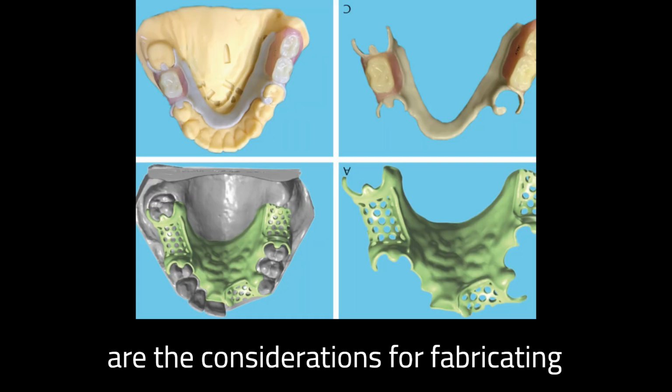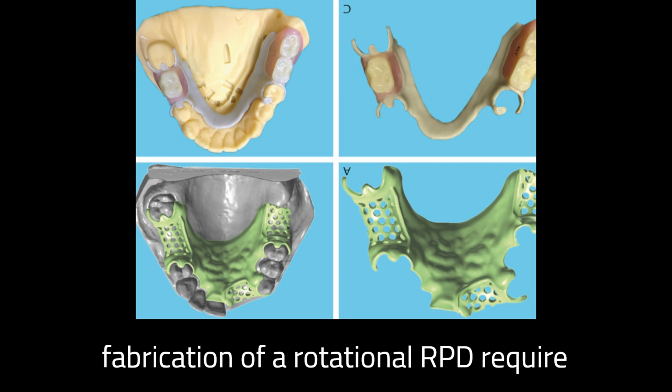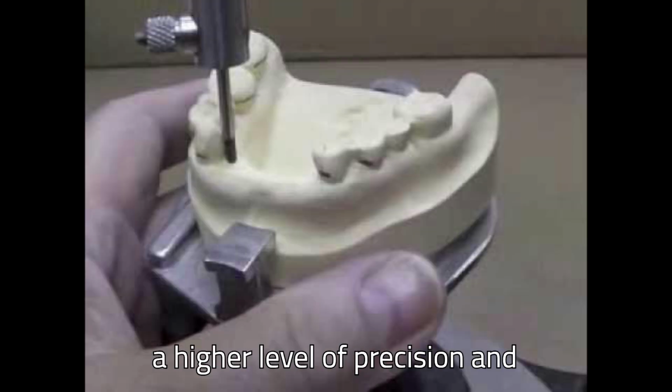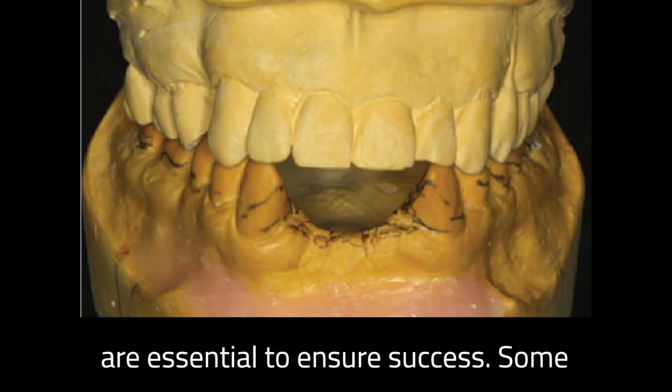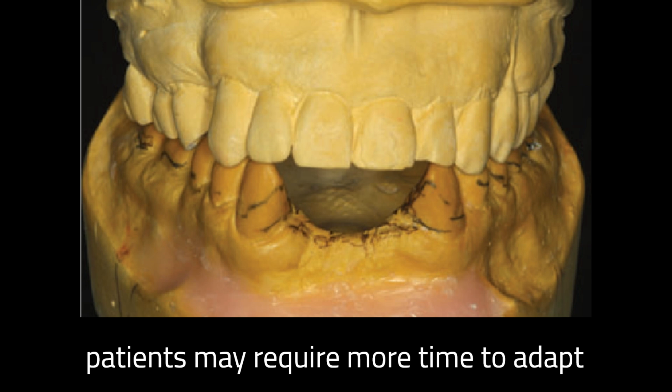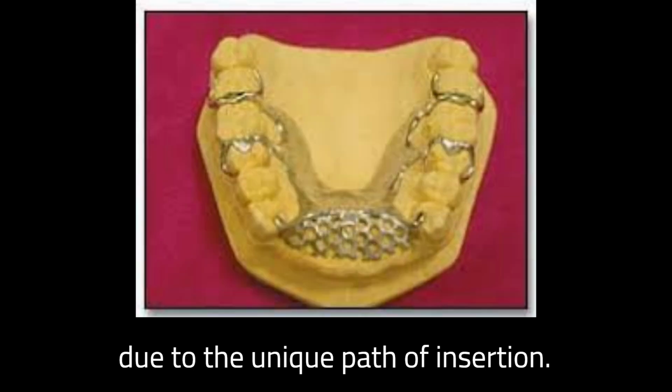What are the considerations for fabricating the rotational RPD? The design and fabrication of a rotational RPD require a higher level of precision and expertise. Careful planning and execution are essential to ensure success. Some patients may require more time to adapt to the insertion and removal technique due to the unique path of insertion.